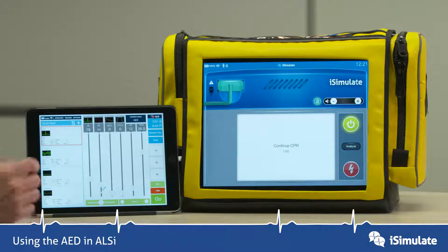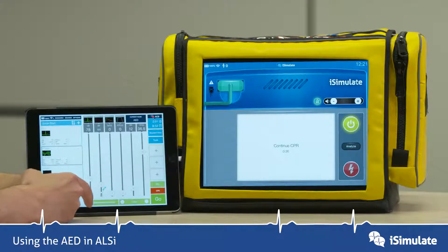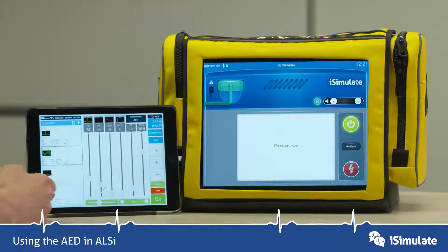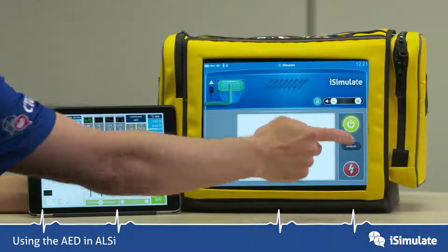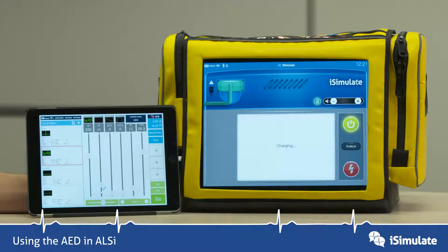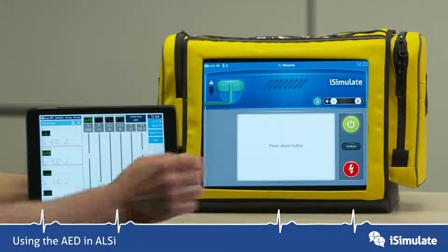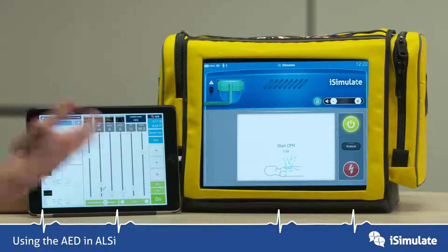Let's change the rhythm now to VF and we can use the virtual time to fast forward. Now we're going to press analyze again — let's turn off the CPR and press analyze. It's recognized it as a VF rhythm and it's going to start charging. Now we press the shock button and we go back into CPR.